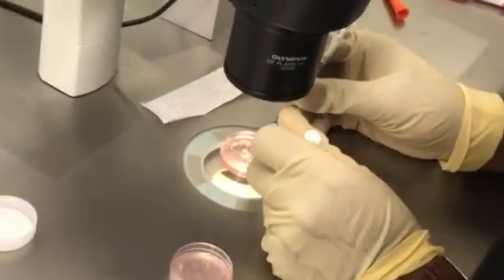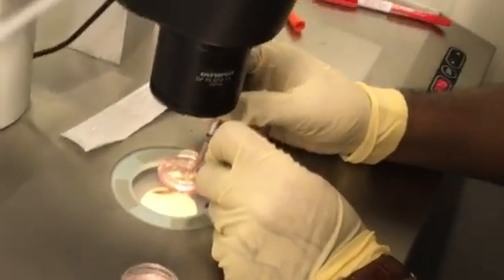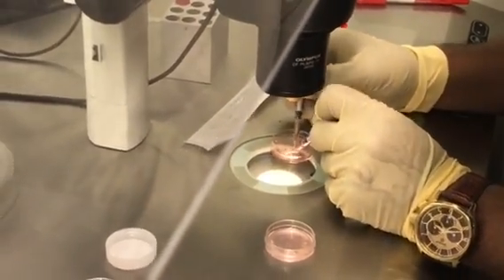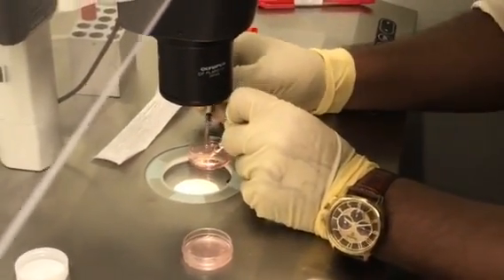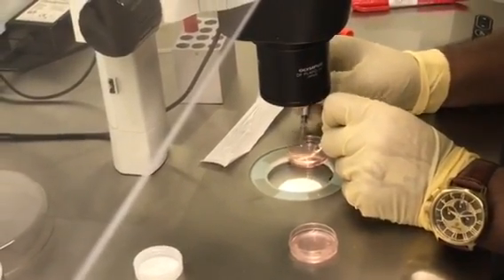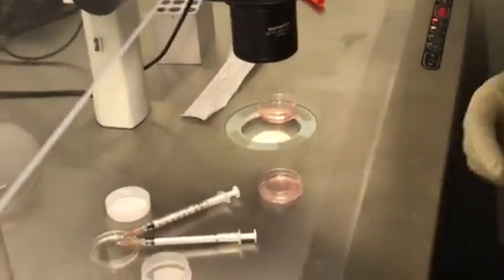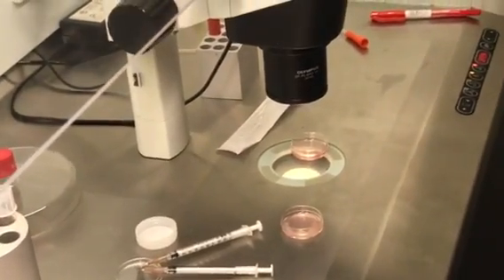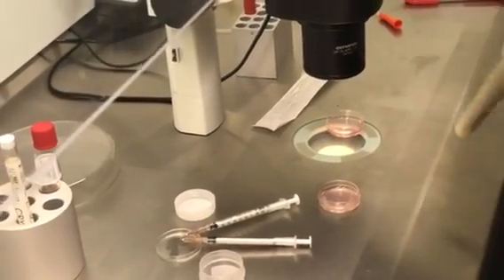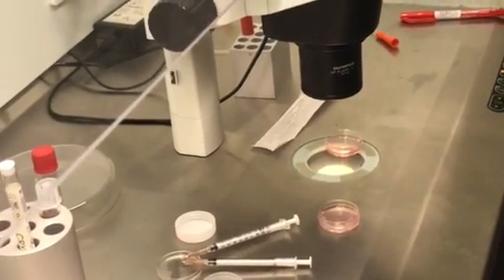After the squeezing, this has a temperature so that the sperm will be alive. If there is any viable form, the sperm will be alive. After this we have to wash, make appropriate aliquots, and freeze it in liquid nitrogen for future trials. When the patient comes, we stimulate the wife, collect the eggs, remove the sperm from the liquid nitrogen, thaw it, and use it. If the sperm samples are motile, we recover motile sperms only because there is much less cryogenic shock.